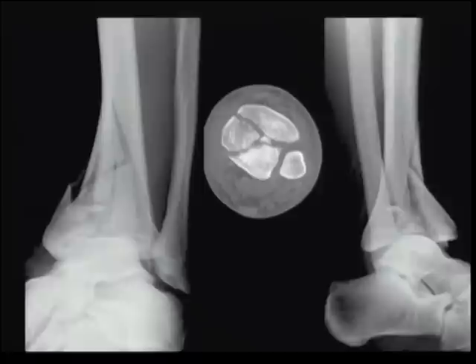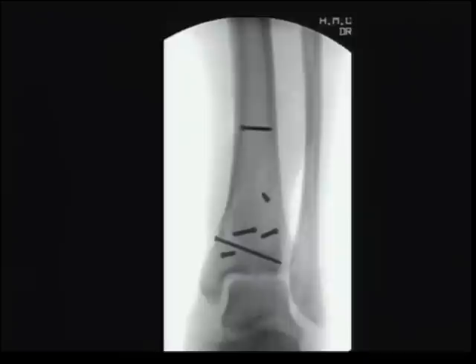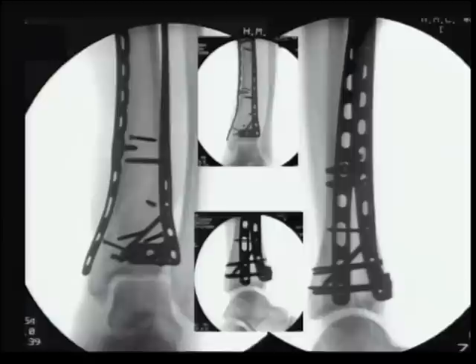So here's an injury. There is a rather medial exit point to this fracture, but it's a simple and straightforward three-part tibial pilon injury, as you can see. This patient had horrible medial soft tissue, so an anterolateral exposure was still used. And this is some of the intraoperative radiographs demonstrating the reduction. Once again, just a sequential reduction from the posterolateral to the medial to the anterolateral segment, followed by placement of small fragment screws in order to stabilize this, and then once again, whatever implants are then chosen to span from the articular segment to the diaphysis to complete the reduction.